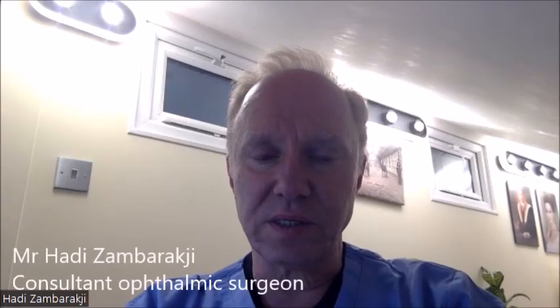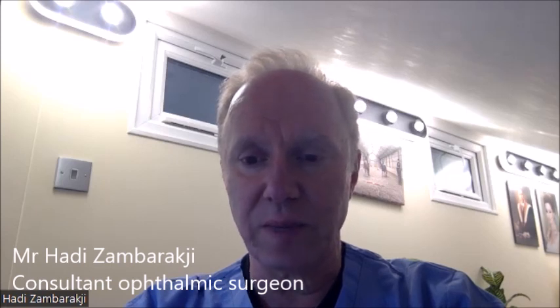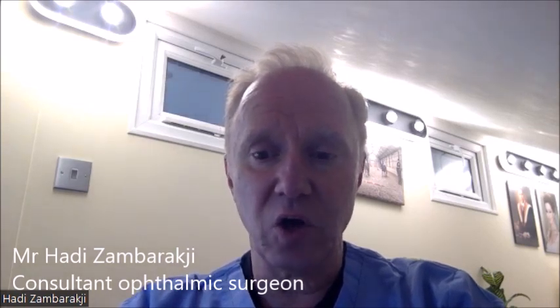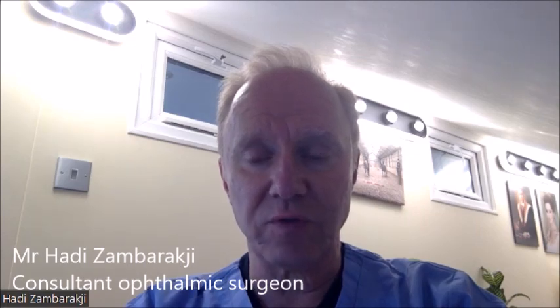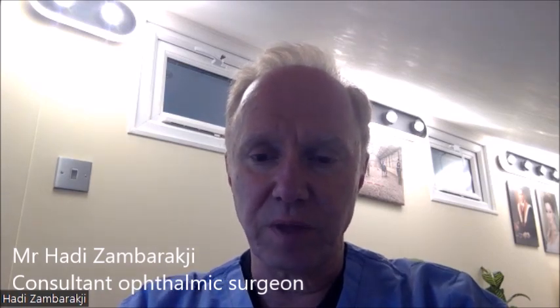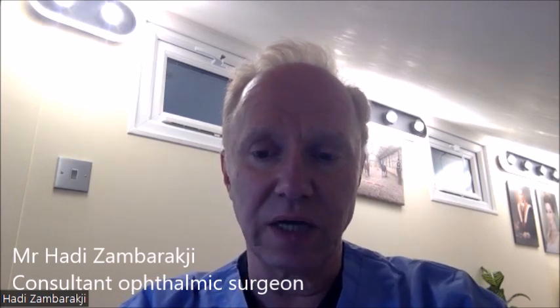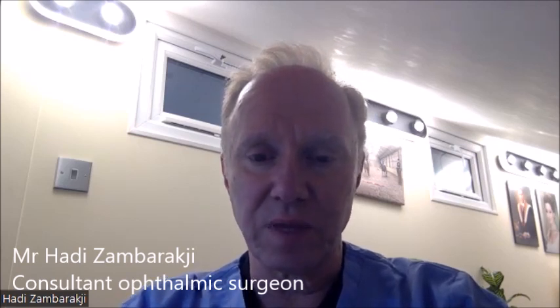So many patients seek an ophthalmic consultation with a view to being spectacle independent. And usually this is either a patient who is in their 70s and 80s and has cataract, or a slightly younger patient who is now reaching the stage where they have become presbyopic and therefore are finding it difficult to have to constantly reach out for near spectacles. And here the patient's purpose for seeking a consultation is that they would like to avoid and stop having to wear reading spectacles.